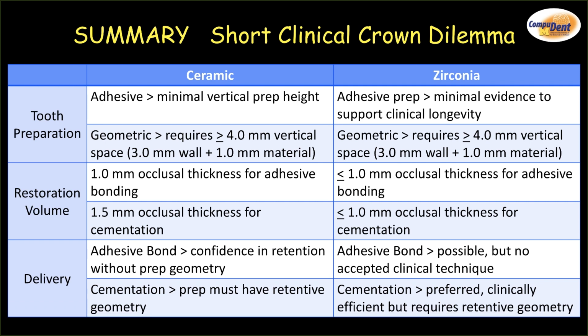And if we look at the delivery technique, can you bond zirconia? Sure, I believe you can. I would love to see more long-term clinical research on posterior single crown restorations to give some clinical evidence to that. But we know cementation is preferred, but clinically effective retention is going to require a good prep. And that's the advantage to the glass ceramics in that we've been bonding ceramics for decades.